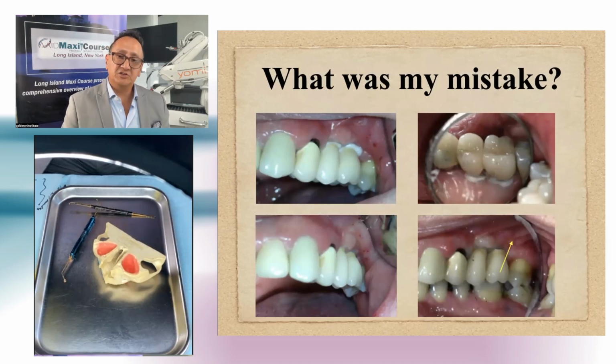Also, if you look at the tissue pool there, there's a, what do you call that? A frenum, and the buccal frenum is always going to pull on that tissue. So I should have done a little frenectomy, right? But you learn these things as you go along, right? As long as somebody just mentions it, you'll remember it. Okay, and this is how it goes. So I'm showing you the muscle pull there with the frenum.